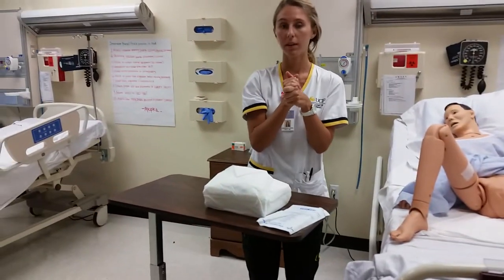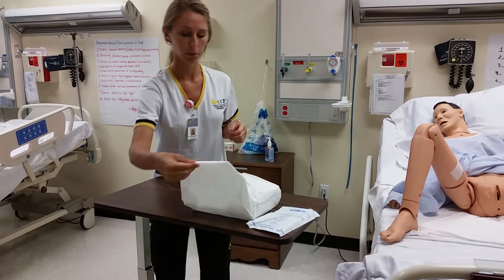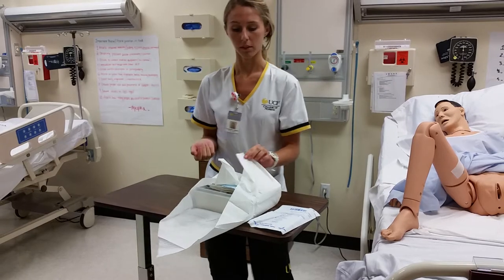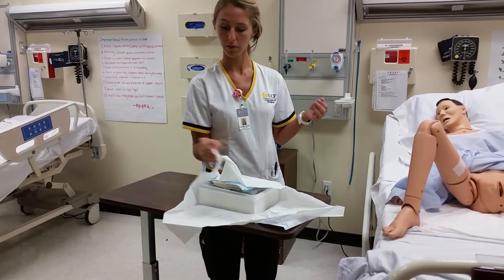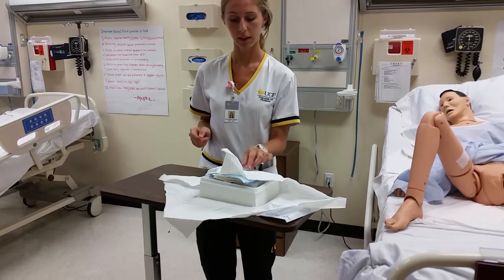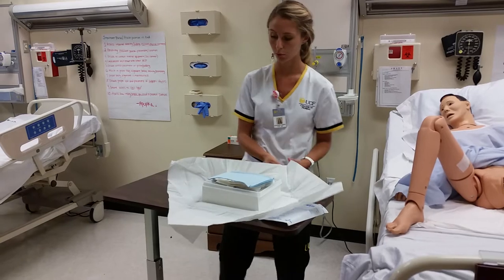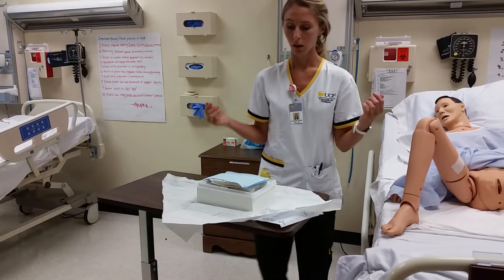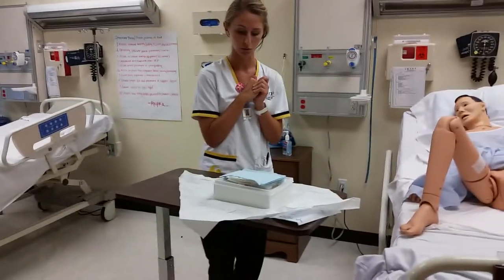Okay, so now I'm going to go ahead and open my sterile kit. So I'm going to open the first flap away from me. I'm going to open the left flap, the right flap, and then lastly the one towards me, making sure to stay within my 1-inch border. Okay, so now that I've done that, I can go ahead and set up the sterile drape.